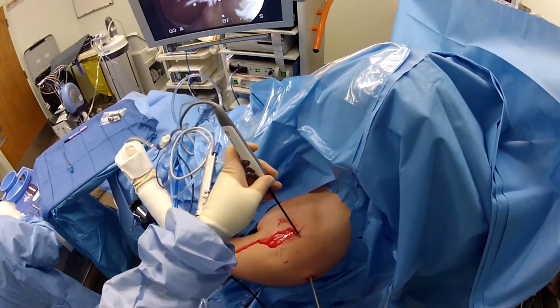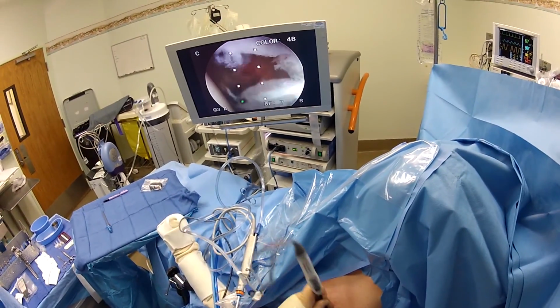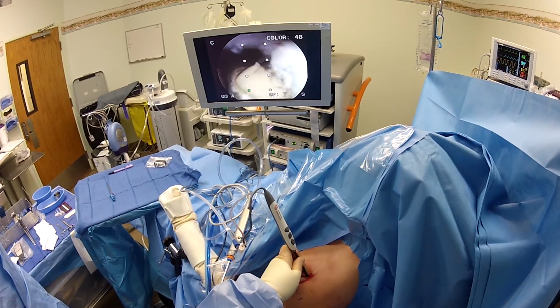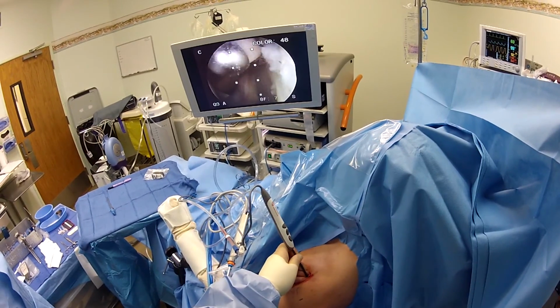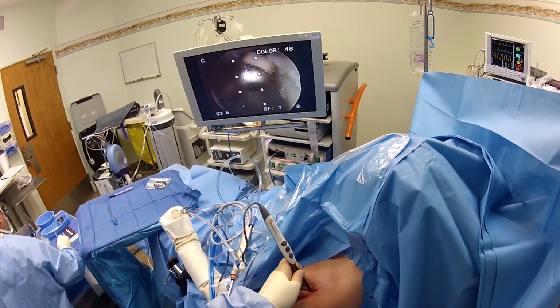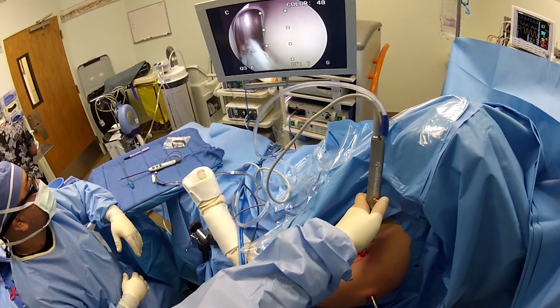So sometimes when I get this tissue down, then you keep shaving it, and it'll just keep coming up, so I'll do a little cautery. Kind of shrinks it up. Just stay away from the cartilage. Oh, see, he's got this labral tearing down in here.